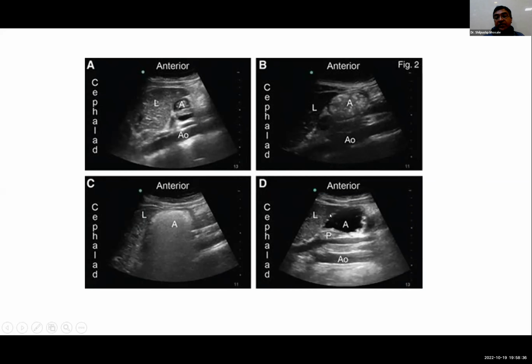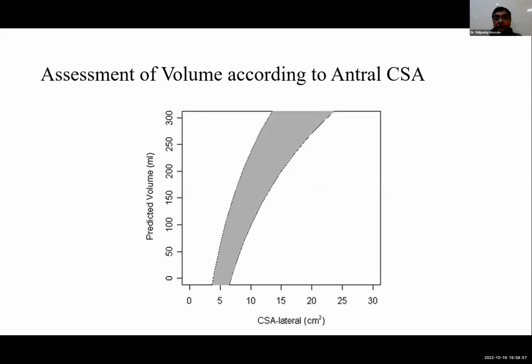And if the stomach is clear, when you have a patient immediately taken for surgery, you will be able to see a clear antrum in the gastric ultrasound.